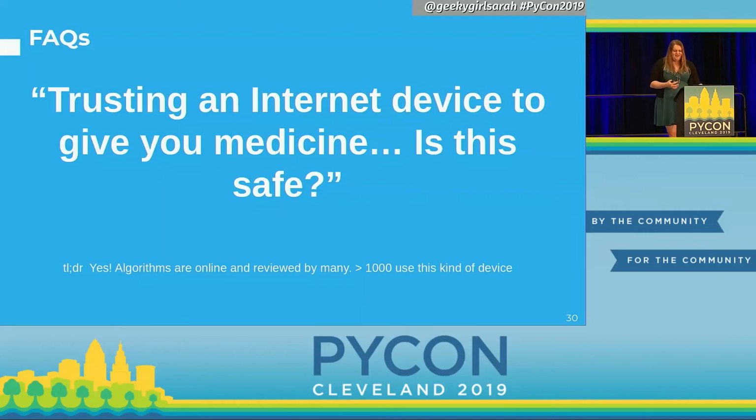Okay, so if this thing is on the internet and it's giving you medicine, is it really safe? And the answer is yes, it's actually pretty darn safe. The woman that discovered the initial algorithm to do this pretty accurately is a researcher and was doing this against her own blood sugars. She ended up getting some values from other people, testing her algorithm against those, seeing if it was responding correctly. Then her husband, a software engineer, wrote some of those into scripts, and some other people found how to wirelessly communicate to the pump. And then all these small scripts came together into this bigger package.